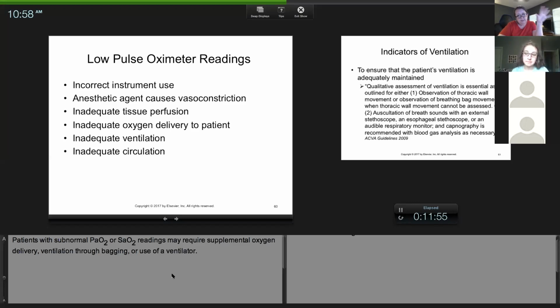The reason I want to stress this is because almost every clinic will have a pulse ox. It's not my favorite because it can give you some false readings, and students, or people first out in practice, sometimes freak out. So I spend a lot of time talking about a pulse oximeter because you're going to have to determine, is that true? Do I believe it? When you get a crappy reading on monitors, everybody goes, it's just the monitor. I'm like, are you sure?